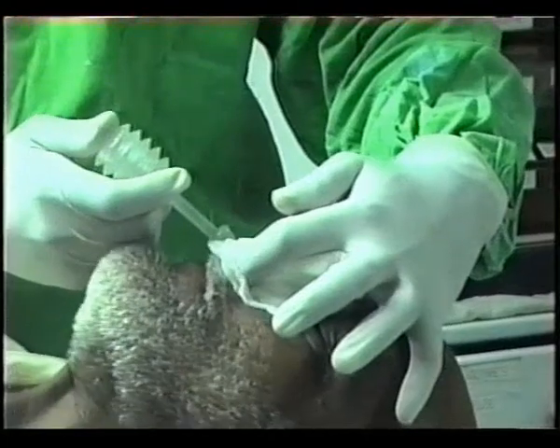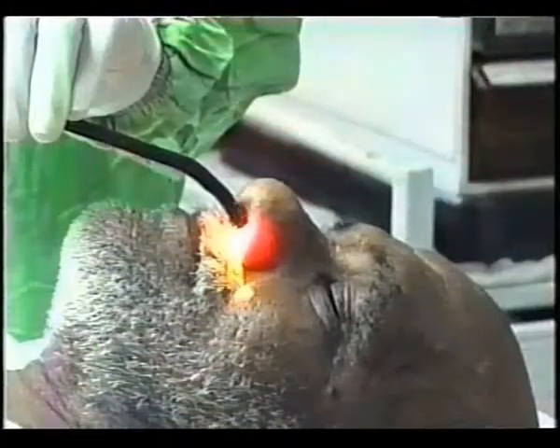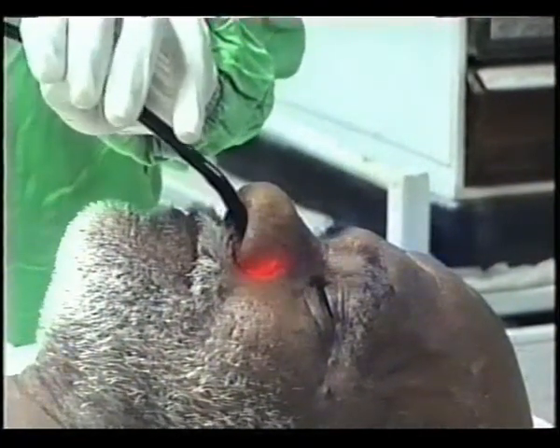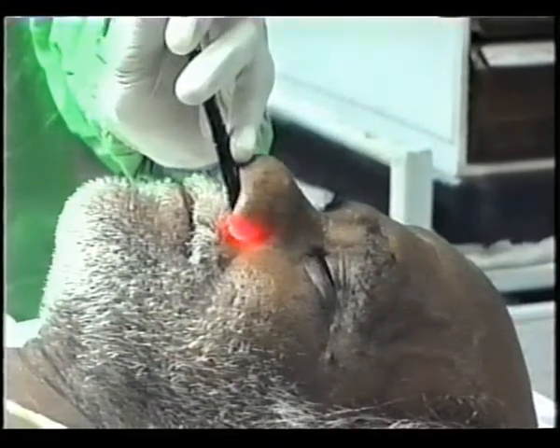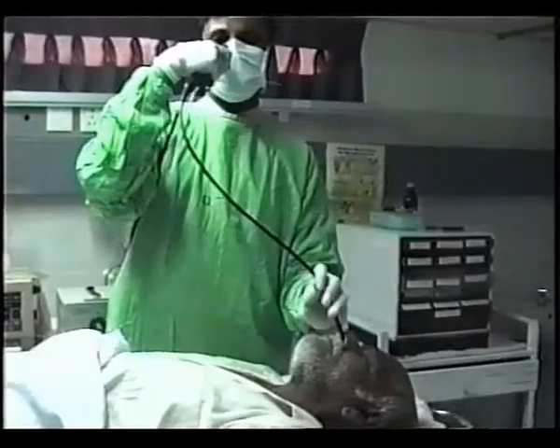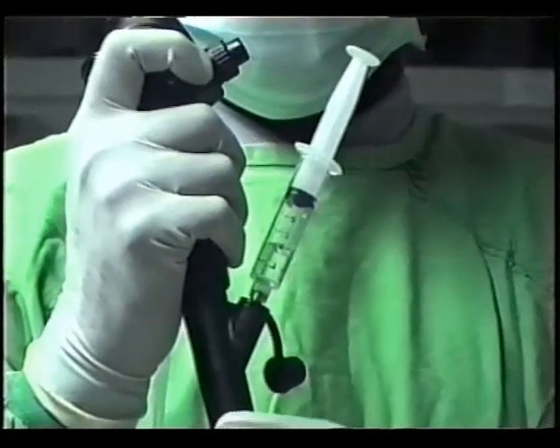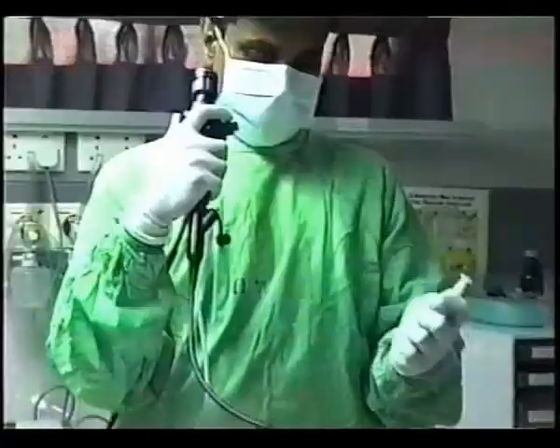Local anesthetic gel is applied to the nostrils and also sprayed into the throat. Bronchoscopy is done without any sedation, without general anesthesia. The scope is passed gently through the nose, and certain sensitive areas within the tracheobronchial tree are sprayed with local anesthetic. This is the vocal cord, a very sensitive area, which is sprayed with a lignocaine spray as you go on.